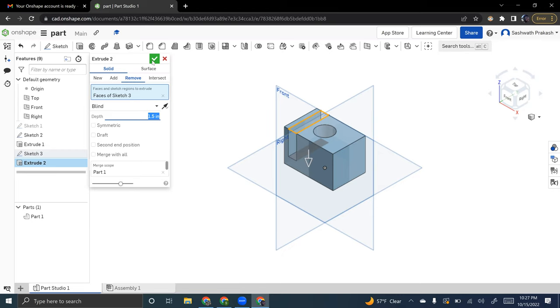When you're making the rectangle, remember the 0.5 and 0.25 thing? You have to make sure you're choosing this top plane when you're drawing it. It's okay that you didn't, because in this case it's symmetrical. So if we have this or this, it's the same thing.